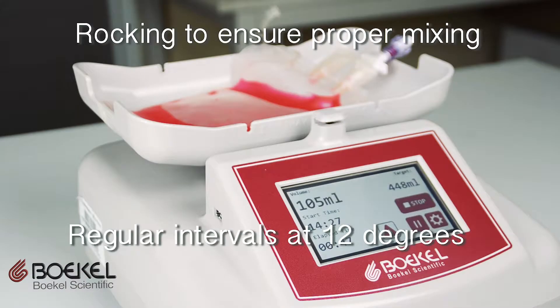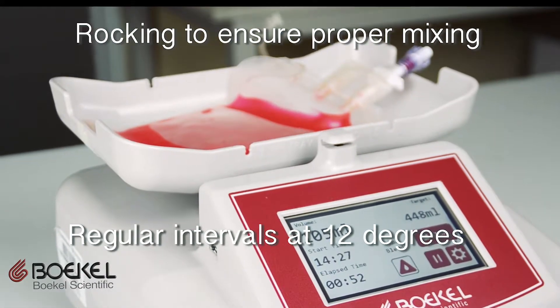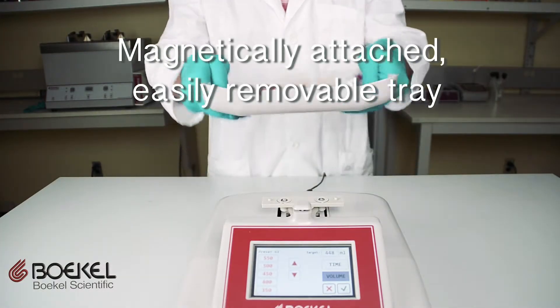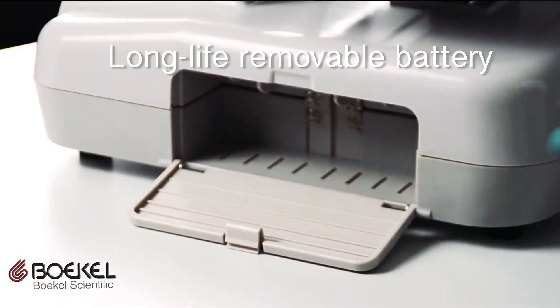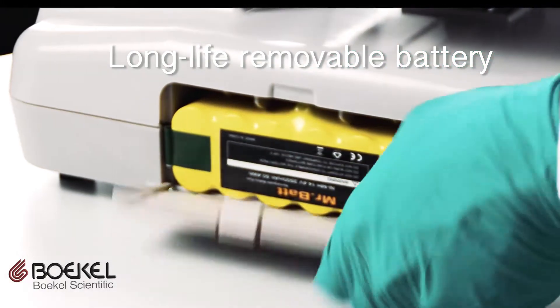The system ensures proper mixing by rocking at regular intervals up to an angle of plus and minus 12 degrees. The tray itself is also incredibly easy to remove and reattach using magnets.